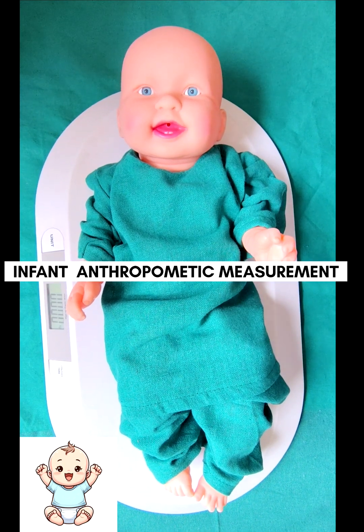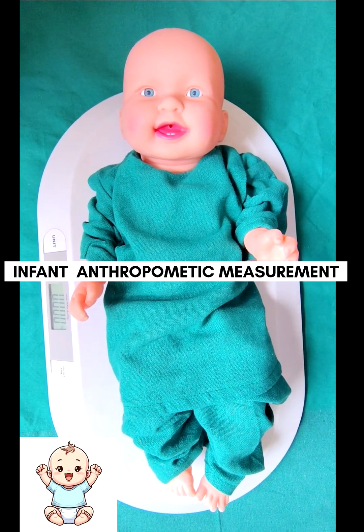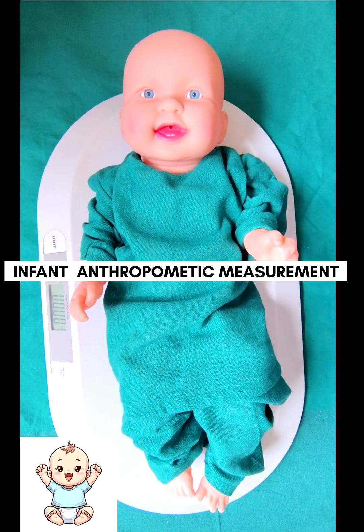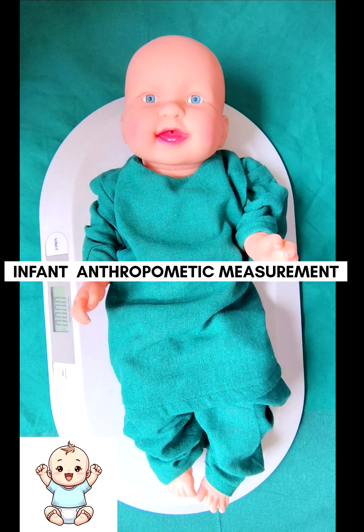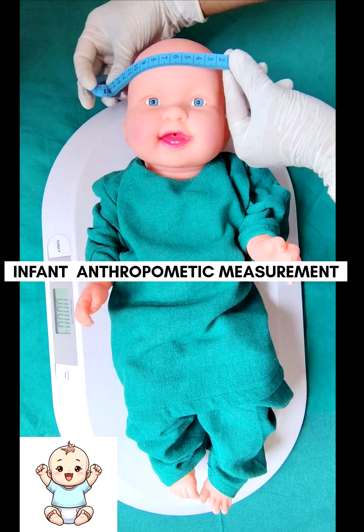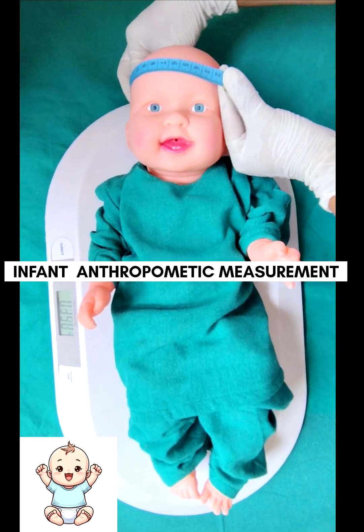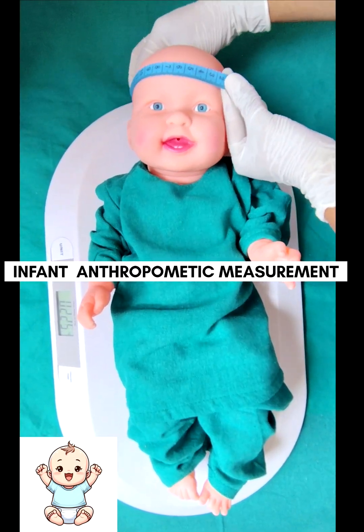Today we are going to discuss infant anthropometric measurement. First one: measuring infant head circumference.